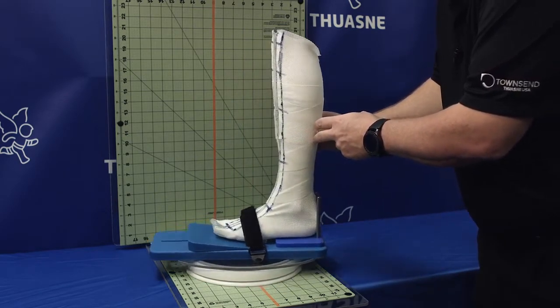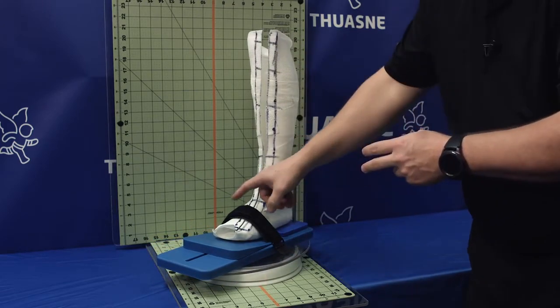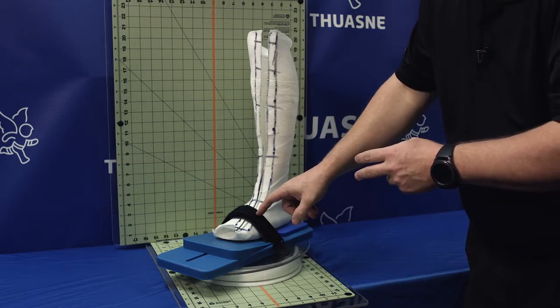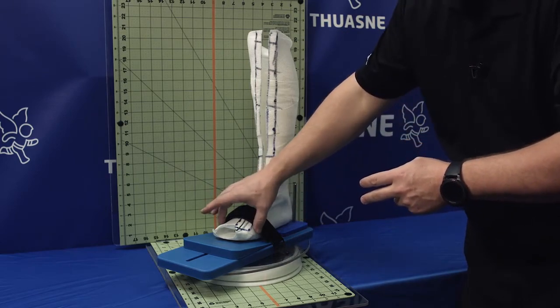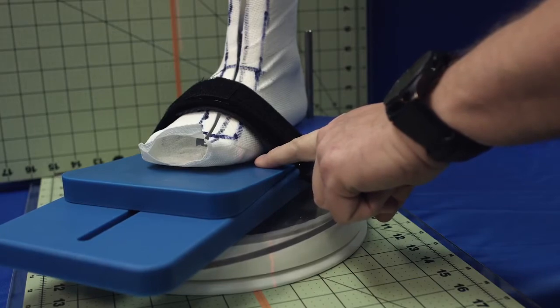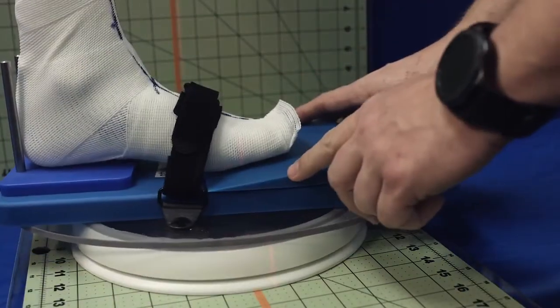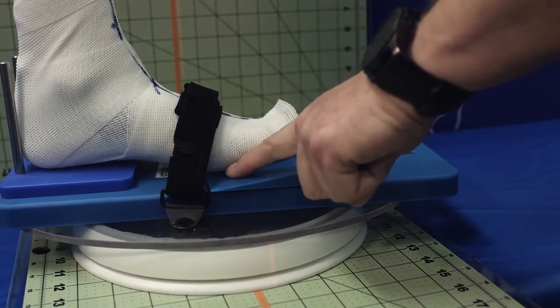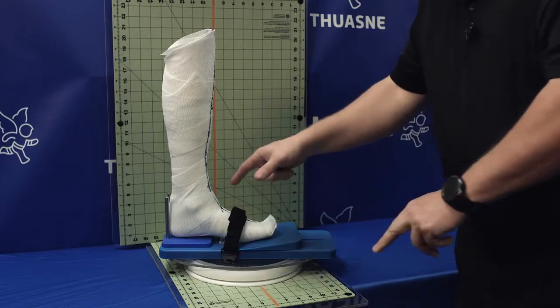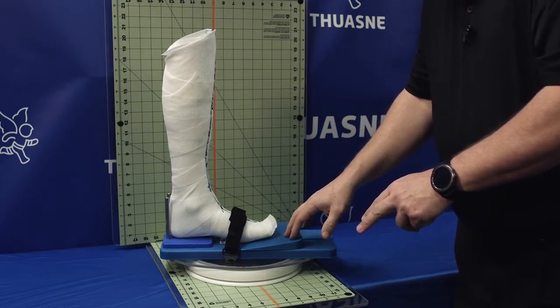We're going to rotate around and we're going to look at the forefoot. So as we look at the forefoot, again, the strap is simulating weight bearing. The cast is nice and rigid, so there's no deformities happening here. And we do have full contact on the fifth met. And then we're also going to check the first met as well and make sure that we have good contact here.